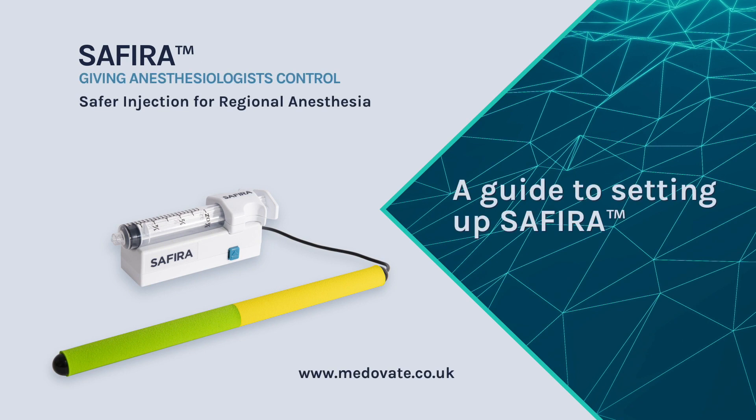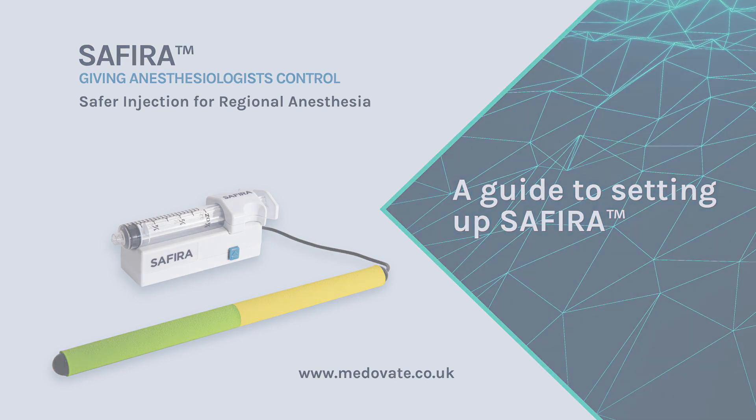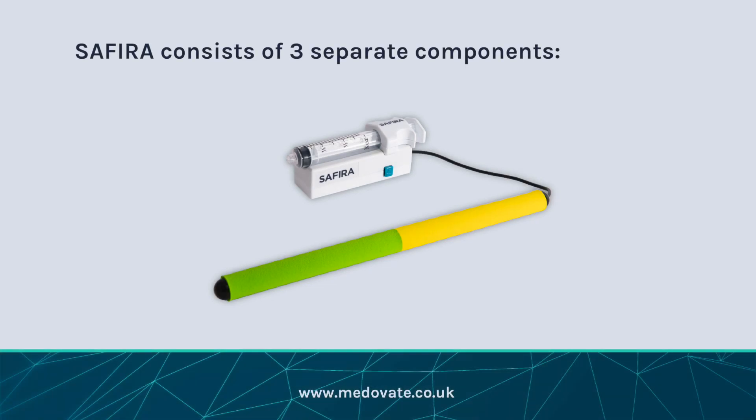A guide to setting up Sephira. Sephira consists of three separate components: a sterile syringe, the driver, and the foot pedal.